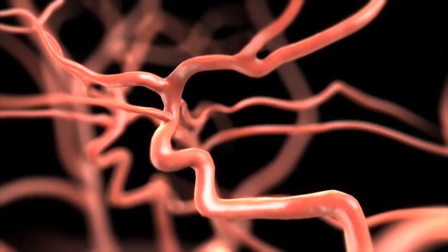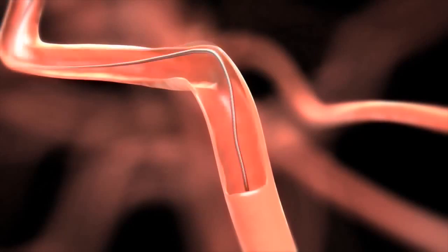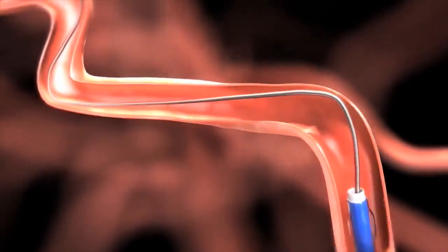So that part of the brain is at risk of dying because of the lack of oxygen and nutrients from the blockage of the blood flow. In situations like this, we can intervene. We can go in from the femoral artery in the leg with a catheter, as you can see here, place it in the carotid artery in the neck, that's the blue catheter.